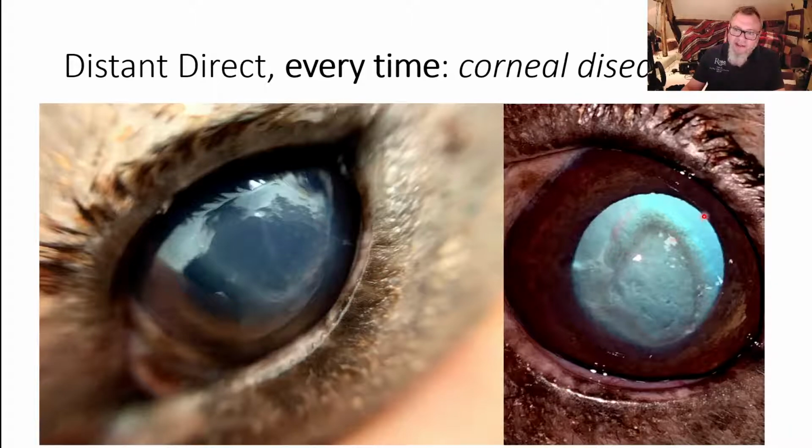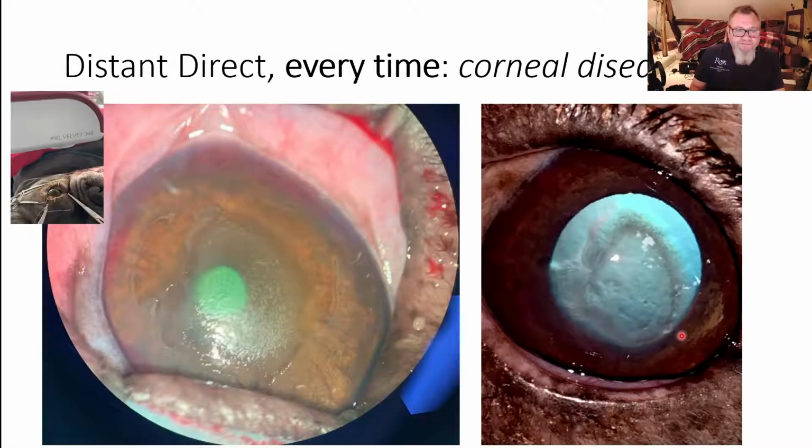And then when we turn the light on, we can see not only is it an ulcer, but it's got this area of infiltrate around. And this is a stromal abscess form. This is an infected corneal ulcer. It's just about to melt. And we met this patient earlier. He's about to have his corneal cross-linking. So this patient's asleep now.